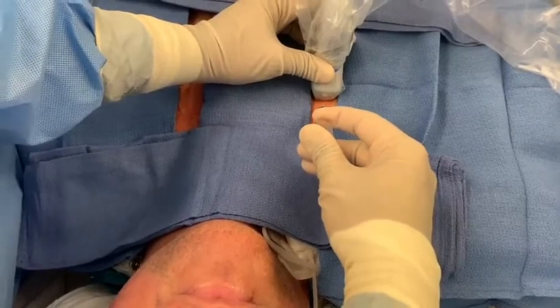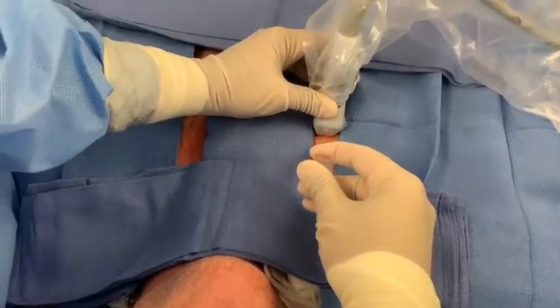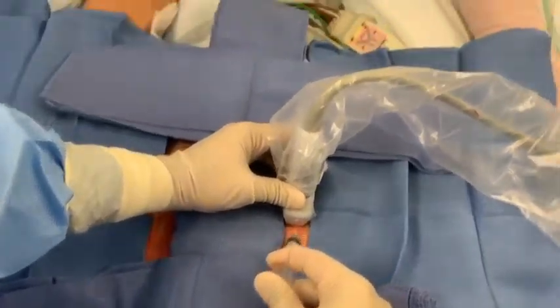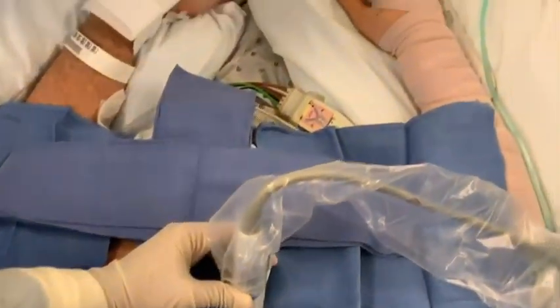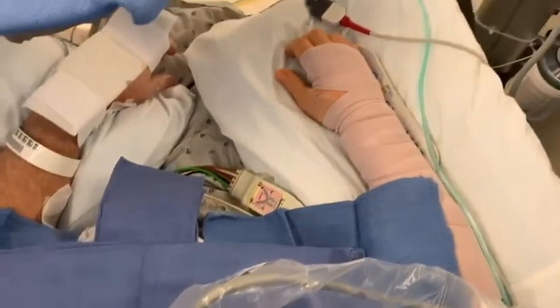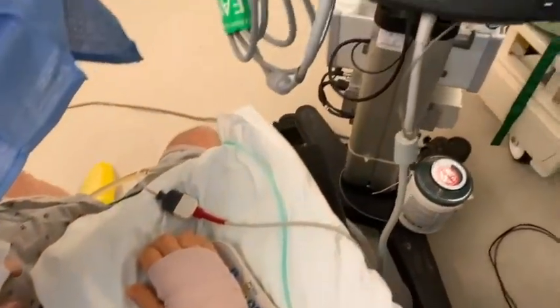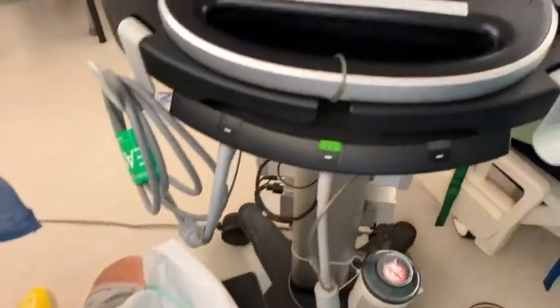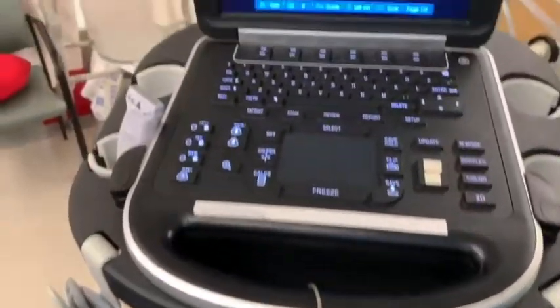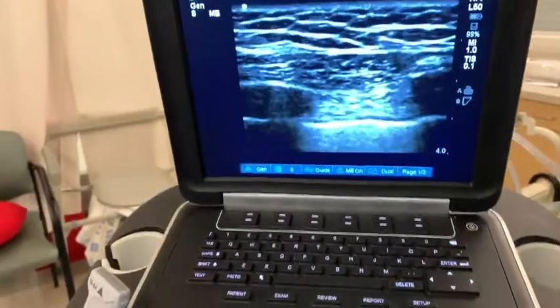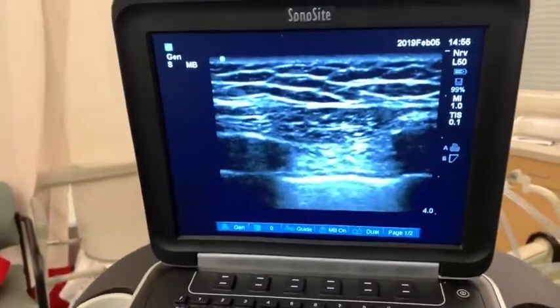For this procedure, the patient is placed in the supine or sitting position with the anesthesiologist located at the head of the patient. The patient is then prepped and draped in a sterile fashion.